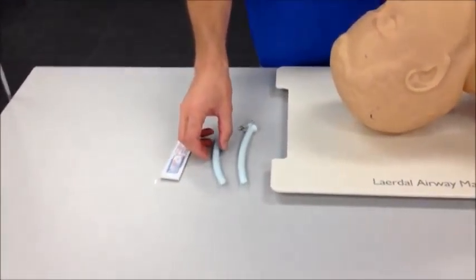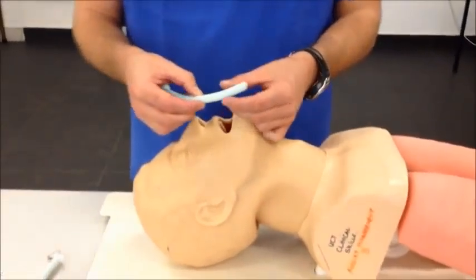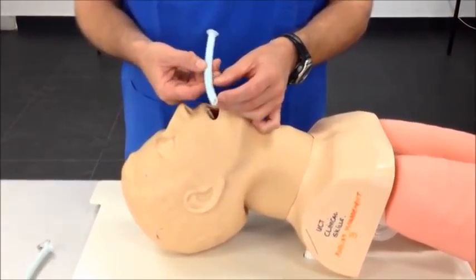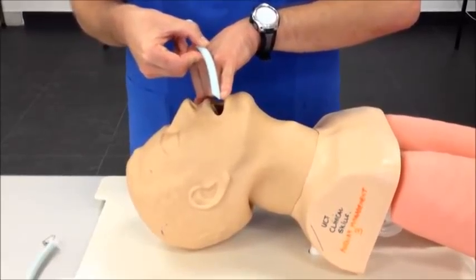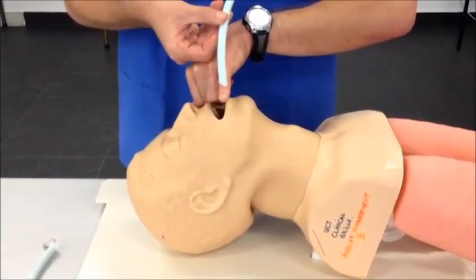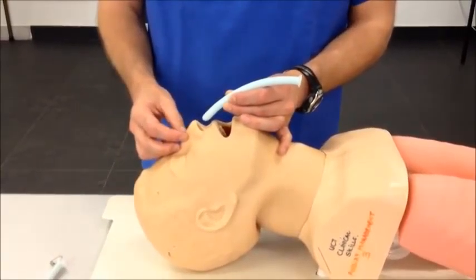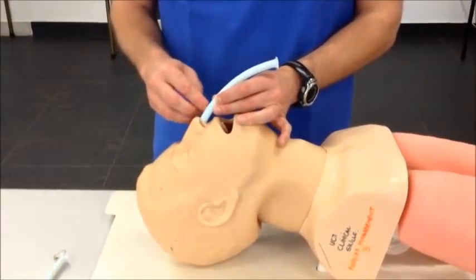There are two sizes to consider, the first being the diameter of the tube and the second being the length of the nasopharyngeal airway. A good rule to select the diameter of the tube is that it should be approximately the same thickness of the little finger of the person in whom the airway is going to be inserted, and maybe more correctly, the width of the little finger's fingernail. Alternatively, it should be the maximum diameter that allows insertion into the nose without causing sustained blanching of the skin around.